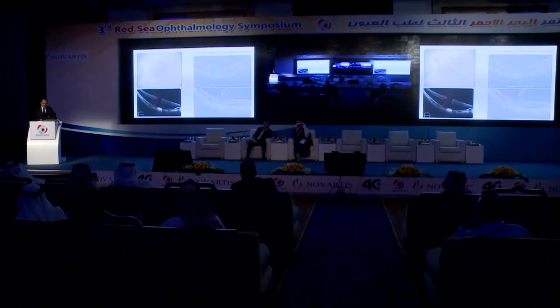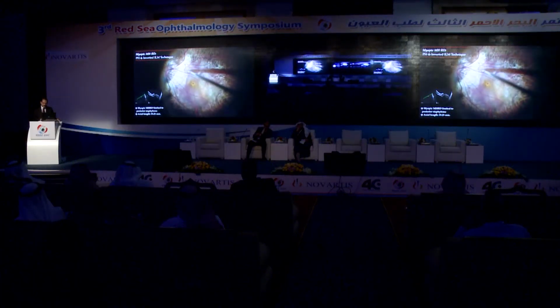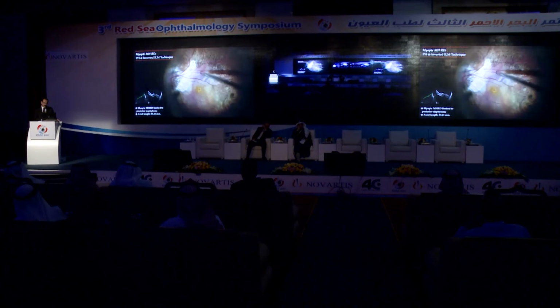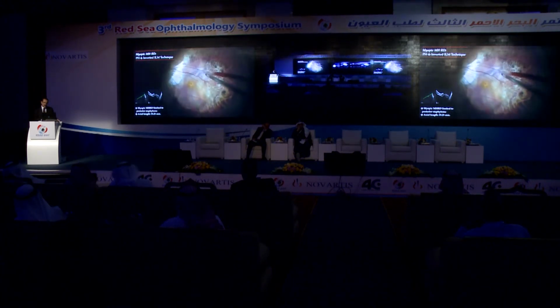And this is the post-operative picture. With closure of the macular hole, the visual acuity improved to 0.4, and these are remnants of the internal limiting membrane. This is again a case of central retinal detachment filling the staphyloma and a large macular hole. Again, the internal limiting membrane was peeled towards the macular hole, trying to create a large flap.